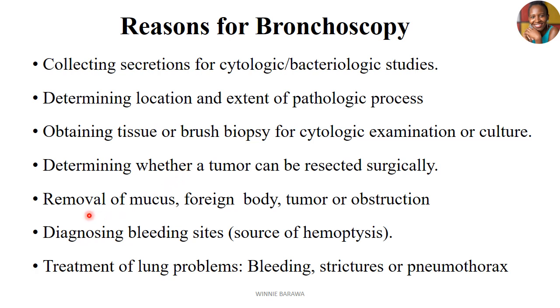Then we have removal of mucus, because as you can see in the bronchoscope, there's presence of brushes that you can use to remove this mucus. You can also go in to remove foreign bodies, tumors, or any known obstructions that are present in the patient. And you can go in with bronchoscopy when you're diagnosing bleeding sites.